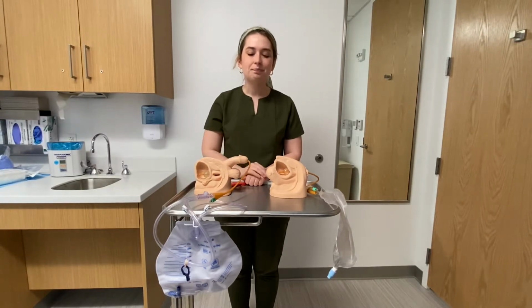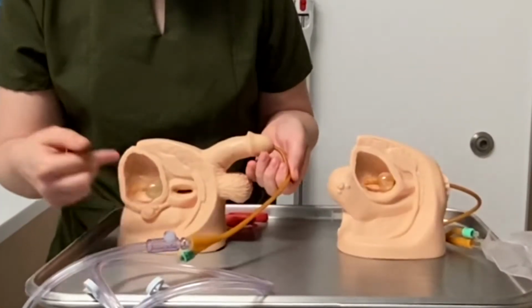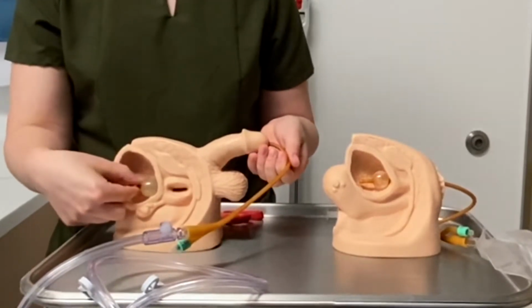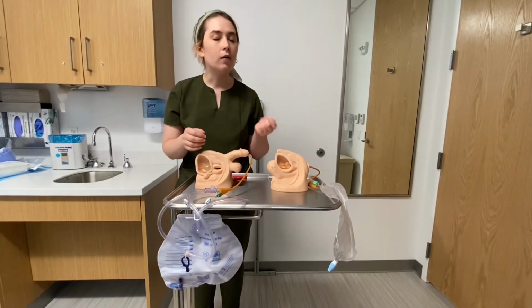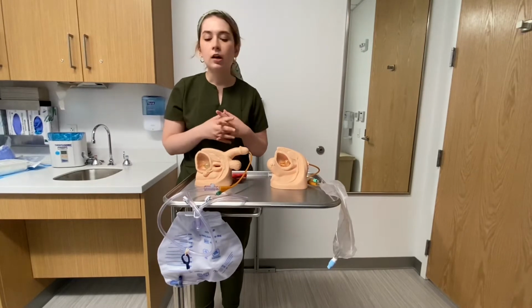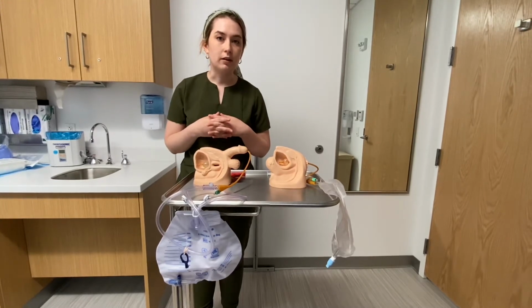Before we remove it, we'll just show the catheter is held in place with a small balloon that's filled with saline. This prevents the catheter from falling out of the urethra. You may notice some movement of the catheter tubing going in and out of the opening of the urethra. This is natural and normal. Just ensure that the catheter is well anchored to your thigh using either straps or the sticker that was provided for you in the hospital.